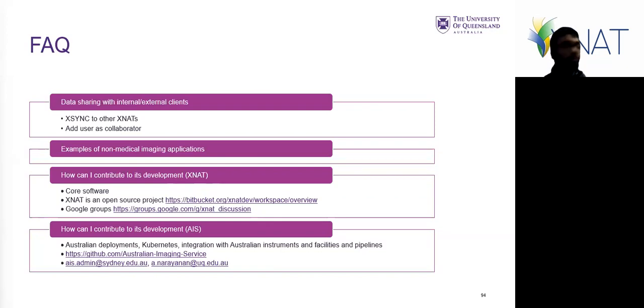Do you make the slides available as well? Yep, sure. I'll put as much of this information onto the documentation as I can. Yeah, because there were some great links in the different components. I think these kinds of talks help outline all the stuff that's missing in the documentation as well. You don't realize it until you have to present everything in one sequence. A lot of the questions were very useful in informing where we need to fill out more information. So that's our top priority now.